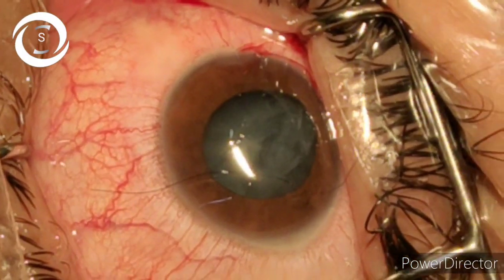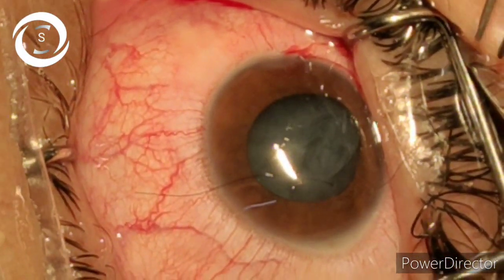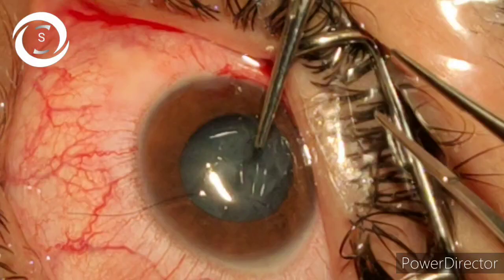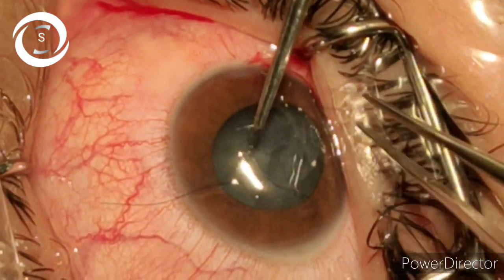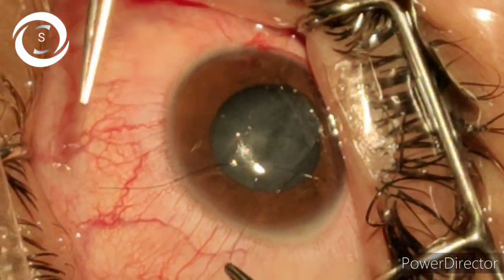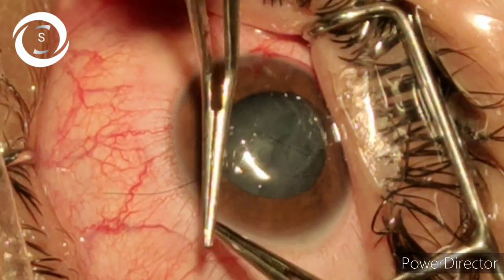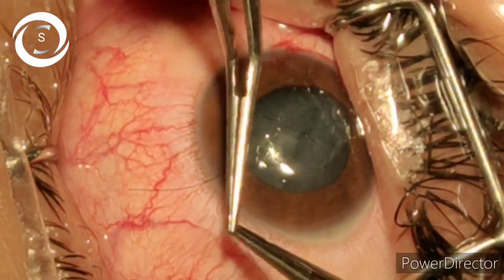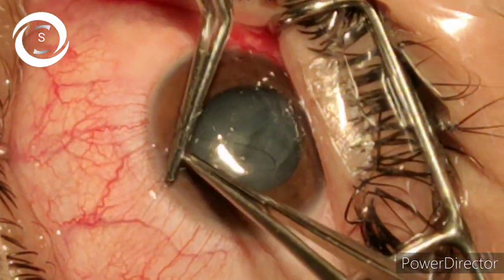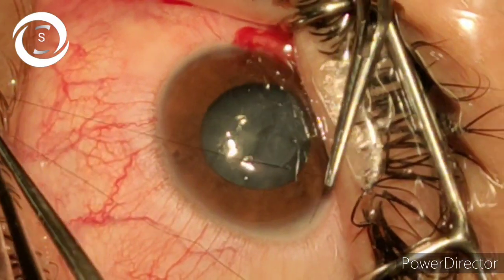You can also see a small round white spot, and that is most probably fungal keratitis — its margins are fluffy. So to be on the safe side I will inject intrastromal antifungal at the end of the surgery.